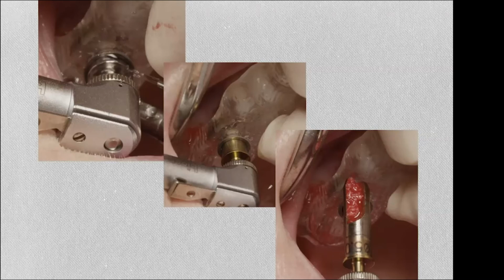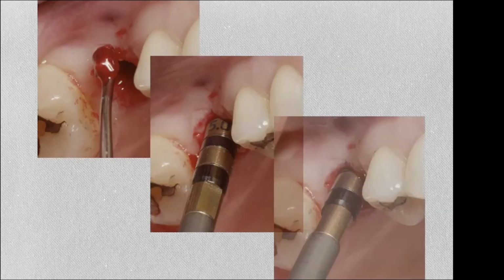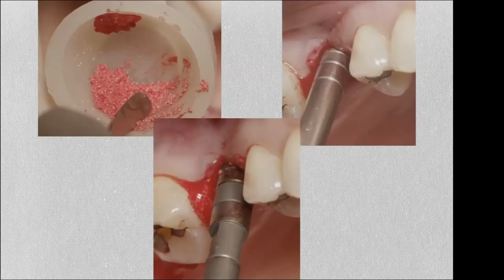Set it aside, take the guide out, keep it aside. Then make sure you still have a floor and place your osteotome. This is not guided now. Tap it lightly, and you will then effect the fracture. And remember, this is a punch right here. Mix your SynthoGraft with the blood, introduce it, tap it lightly.